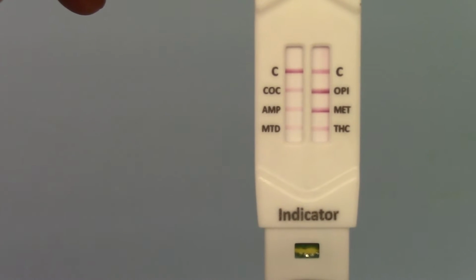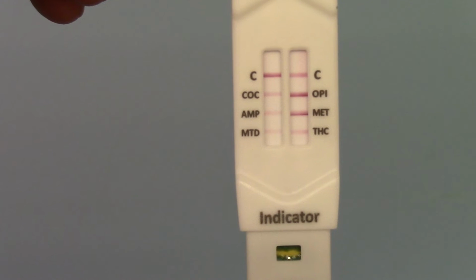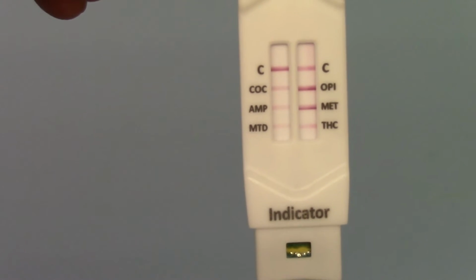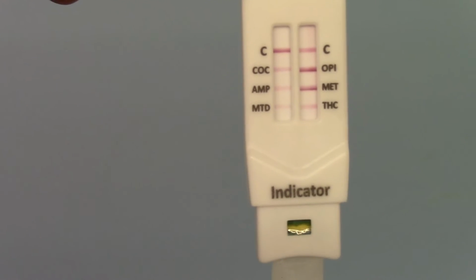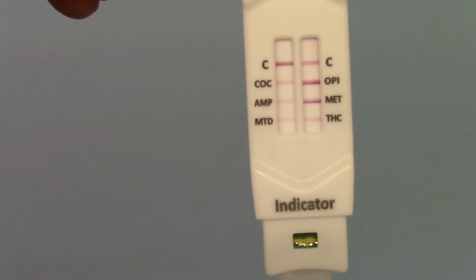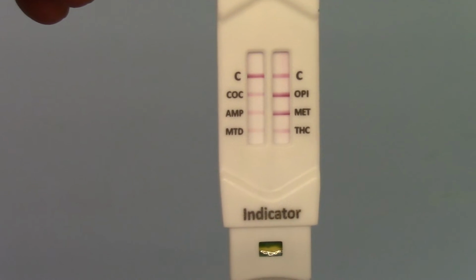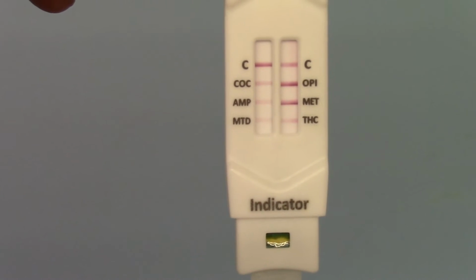And you'll see the test lines that are formed against the opiate and MET membranes are dark and thick. The test lines that are formed against the other 4 are thin and faint. But this is an entirely normal phenomenon with these saliva and other drug tests. You will see variation in the test line.